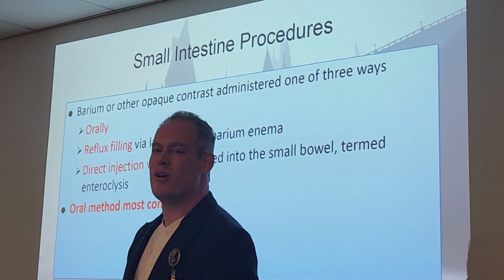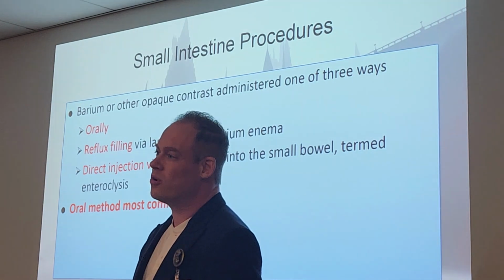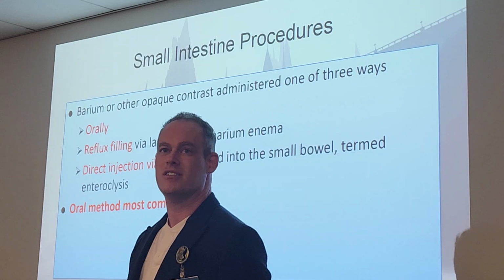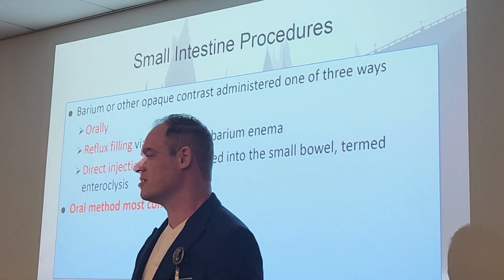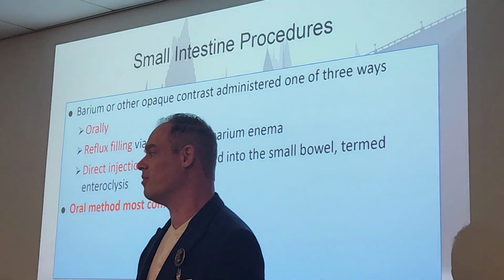Let's talk about our small intestine procedures. It'll be our small bowel follow-throughs, the ones that can be very short or take all day or take 2 days sometimes, depending on the patient. Depends on how fast it goes through the system. Sometimes I've had babies go for 48 hours.